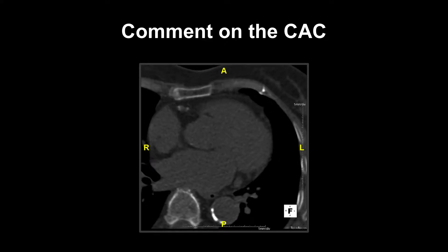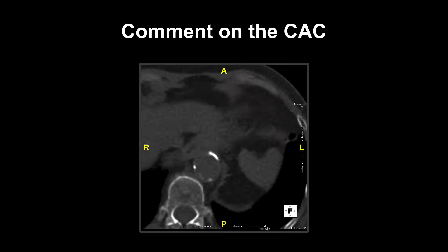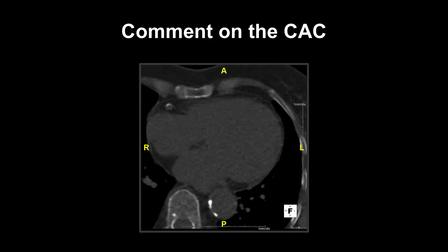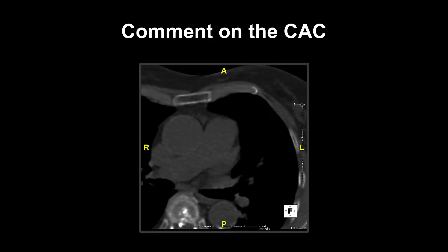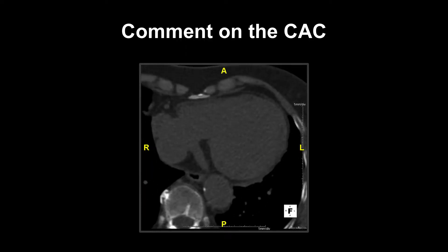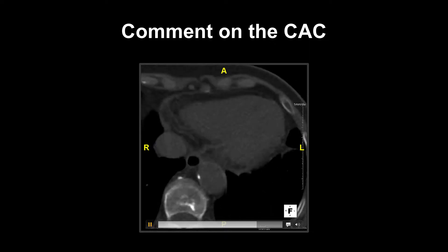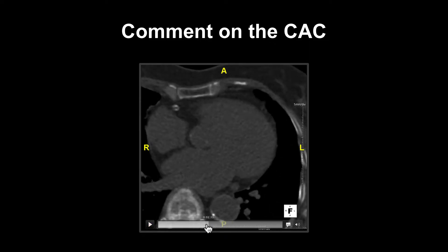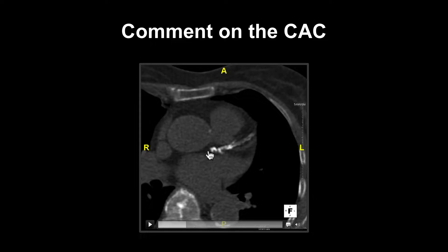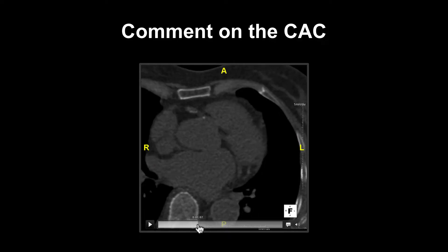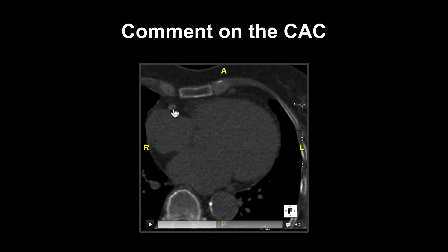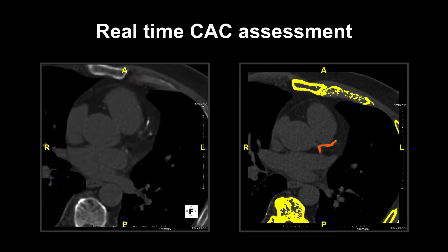I would now like you to comment on the coronary artery calcification seen on the current scan. Let us look through this case together. Were you able to see the calcification at the left main stem, the proximal LAD segment, and the mid-LAD segment, and also coronary calcification in the left circumflex artery, the proximal right coronary artery, and also the mid-right coronary artery segment?